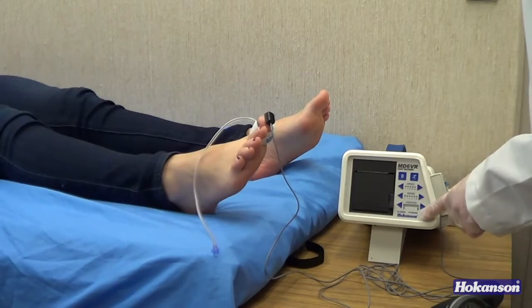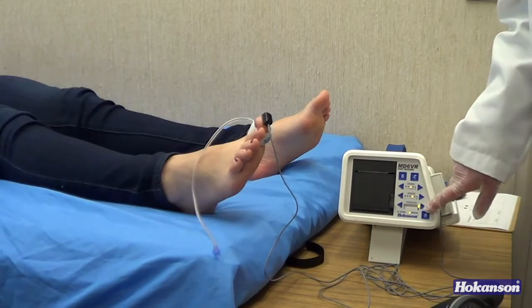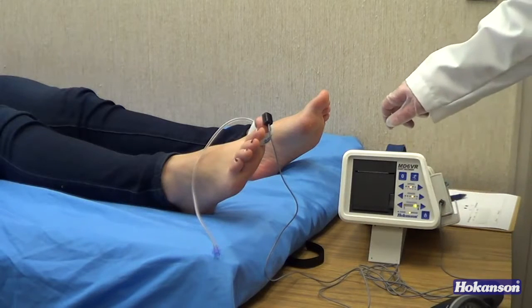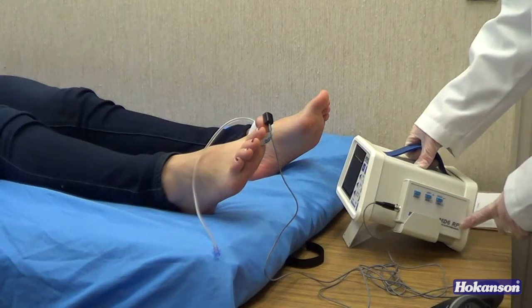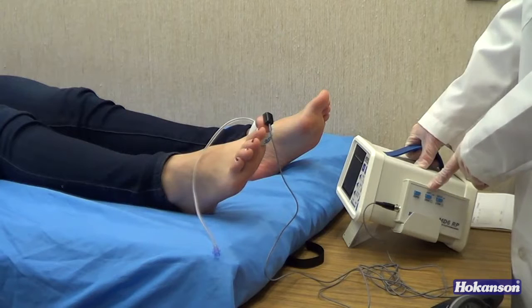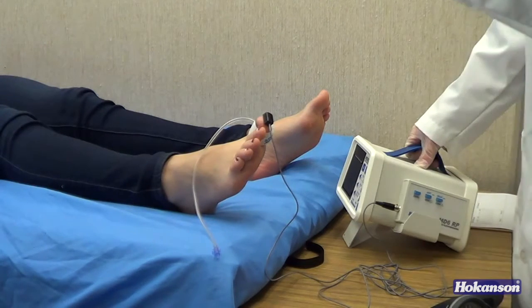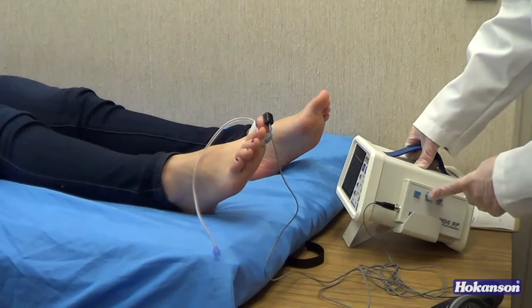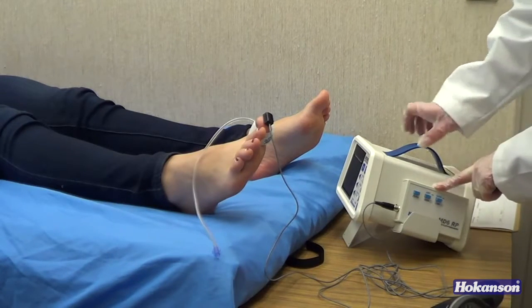Turn on the MD6VR chart recorder and you'll see the patient's waveform pulsing on the position bar graph. Make sure that the MD6RP is set to artery mode. This eliminates baseline change, which is not desired in doing a blood pressure with the photoplethysmograph. So make sure that the button is in the in position, so artery mode is pushed in.